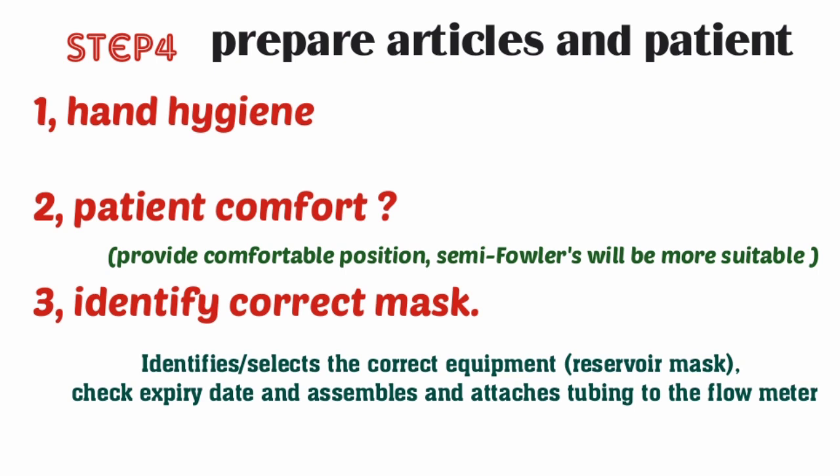Step 4. Prepare articles and patient. First one is hand hygiene. Do hand hygiene according to WHO guidelines. Then make sure the patient is comfortable. Provide a comfortable position to the patient. Semi-Fowler's will be the most suitable for oxygen administration.